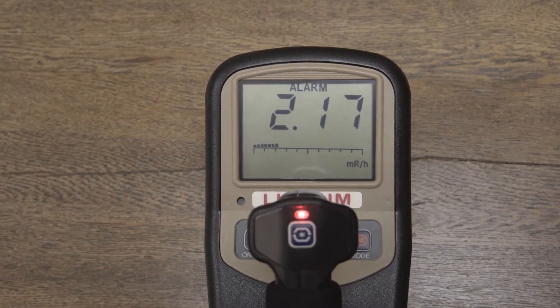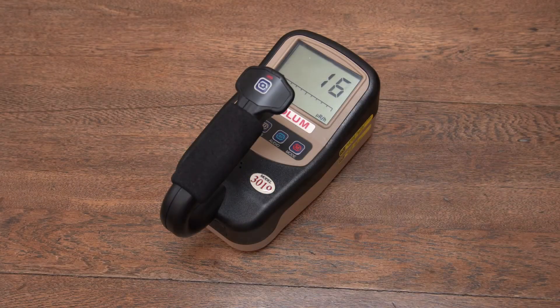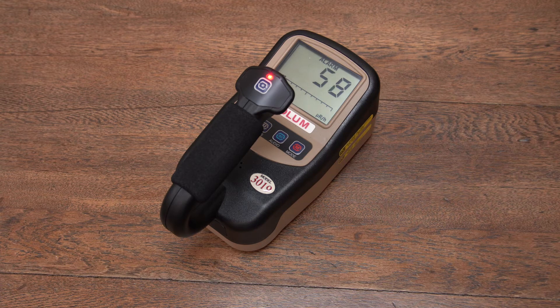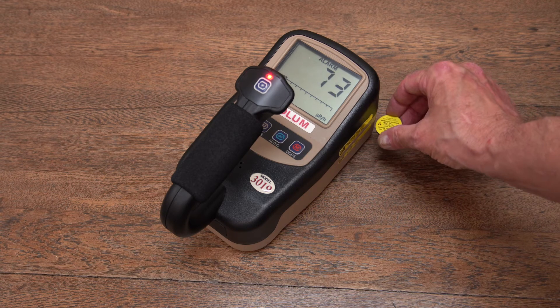There are audible and visual notifications if an alarm level is exceeded. The Model 3019 has a sigma audio feature that can be enabled to assist search efforts by responding with audible beeps only when it detects radiation above background levels. Users are freed from watching the numeric value to find something — they can simply listen for beeps.